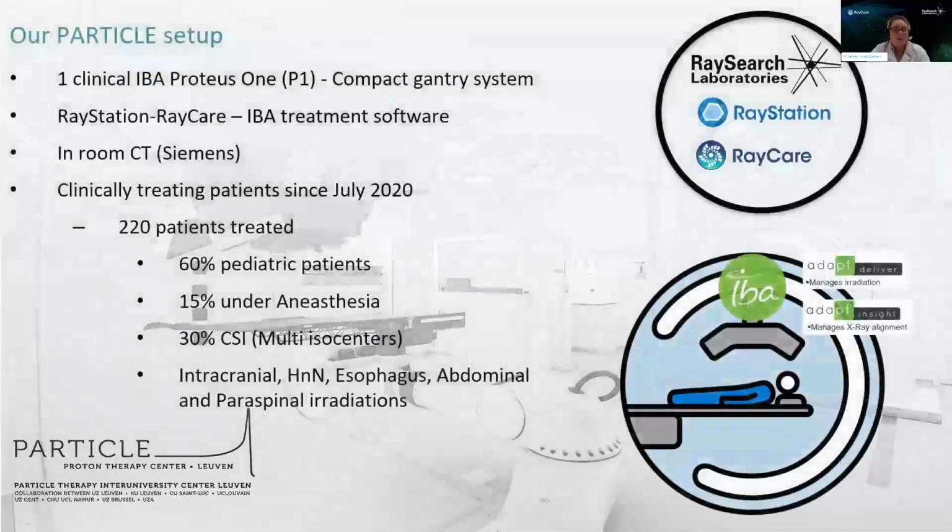And I'd say, yeah, welcome to our particle setup. Particle being the name of our proton therapy division located within UZ Leuven. We're collaborating within a network of university hospitals here within Belgium. At our facility, we have our IBA ProteusOne, consisting of a compact gantry. So rather than a full 360-degree gantry, we have the 220-degree gantry. And in order to treat both sides of the patient, we need to rotate our table 180 degrees.